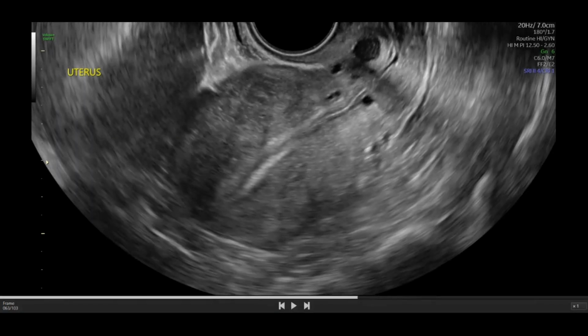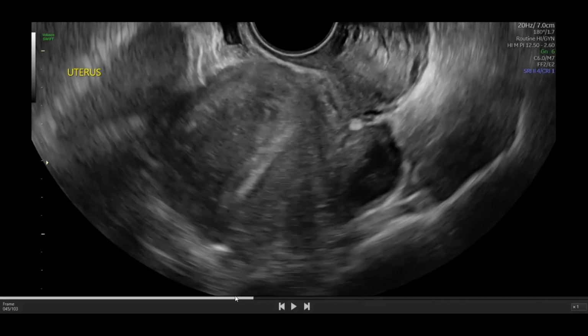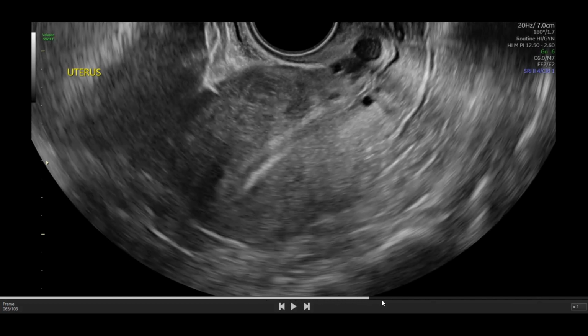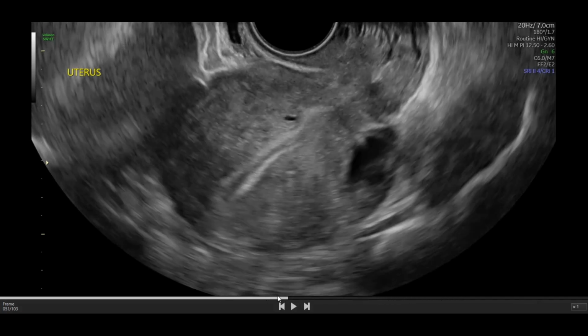Can pause again. This is the next clip. Have we captured anything else? There's another myometrial cyst there. You can see how in some clips, some things are more obvious than others. So the onus really is on the person capturing the pictures and the videos to show us what's there.